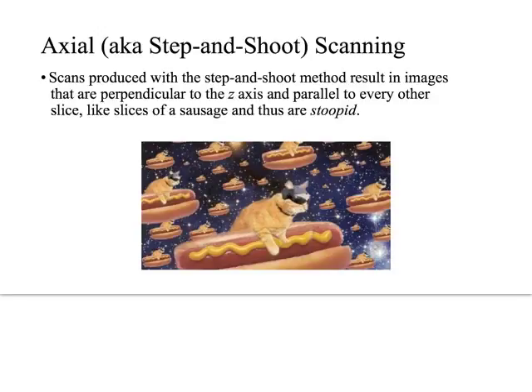That's the best answer they could give you, is that's what we've always done, right? Now I'm going to have to edit that part out of the video. But the important point here is that this axial scanning does not have the benefits that it used to have in the past, and yet we continue to do it simply because that's what we've always done. There's a lot of things like that in X-ray, in our fields, in allied health in general, I would say, and I think every single one of them is worth questioning. So whenever you find something like that, it's appropriate to ridicule people a little bit.